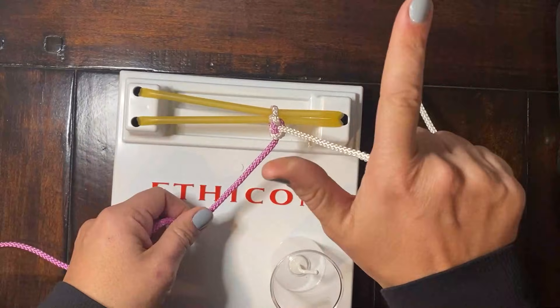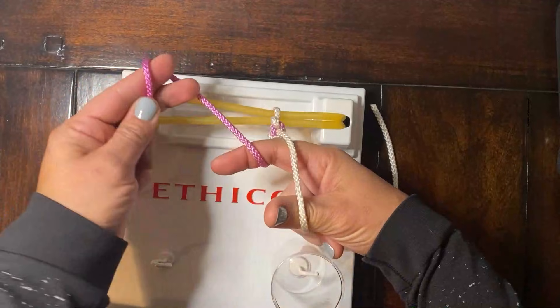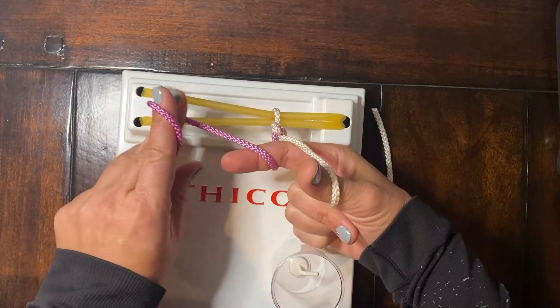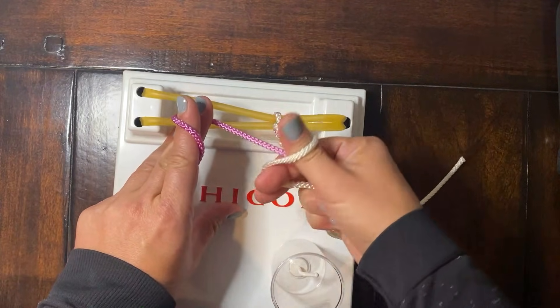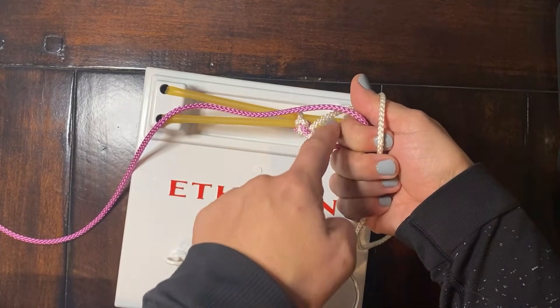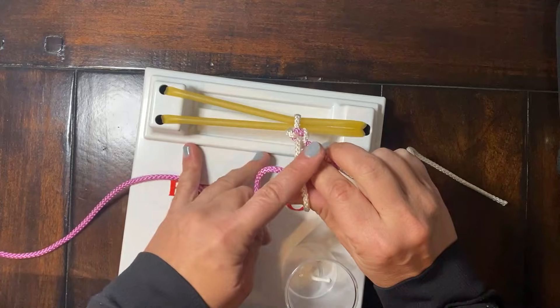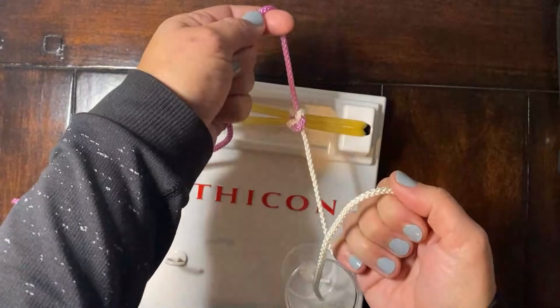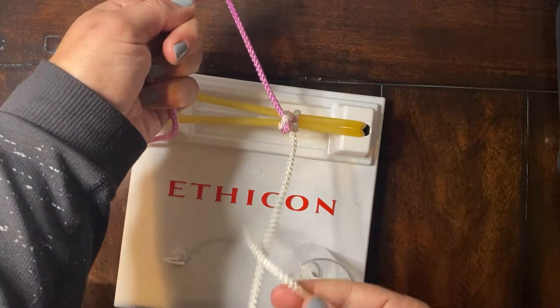Next time through, J, and wrap it underneath. Wrap the purple end over the index finger, which is the only one that can work. Come over purple, under white, and you can see we're going to end up pulling under the index finger here in this little triangle — that's where the knot is made. This time, to make square knots, we pull the opposite direction, which is towards you.